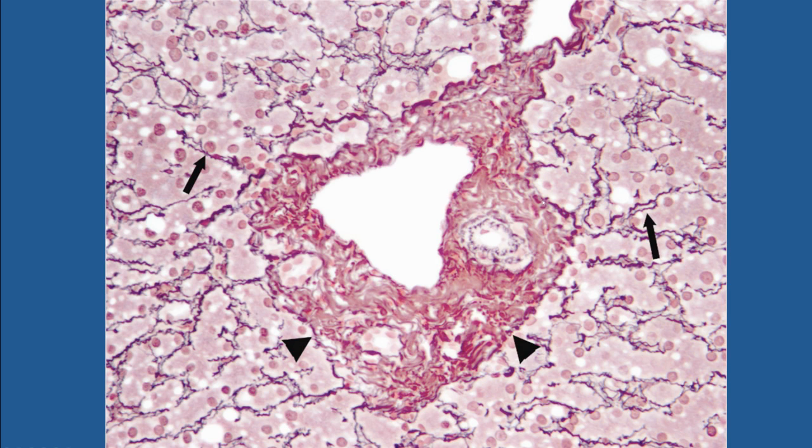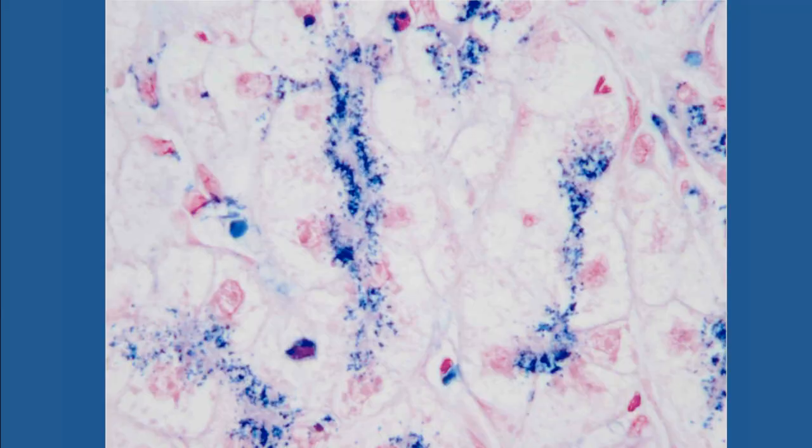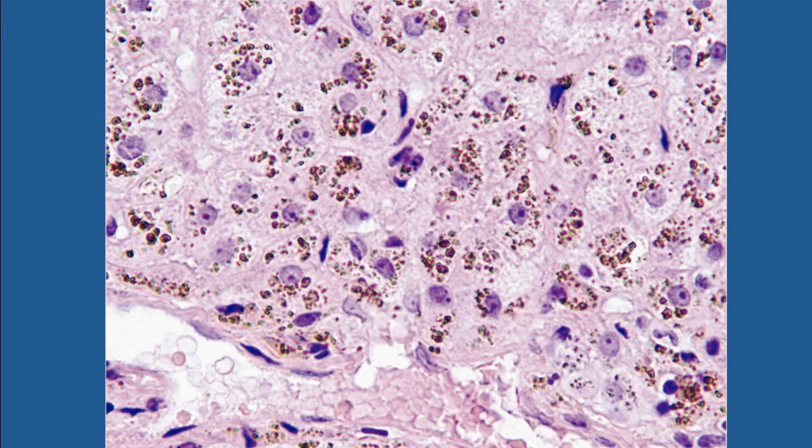The color of the reticulin fibers is different, but you do need a very well stained slide for that. The iron stain, or the Perls' Prussian blue reaction, as you know, hemosiderin comes up nice and blue, the Prussian blue color, and it stains iron, which you can see on an H&E stain as brown pigment that is refractile.